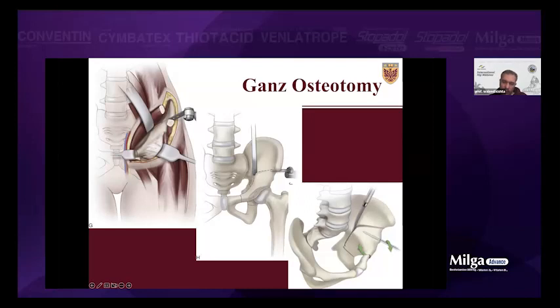This is a very perfect view, and this is a cut we did initially. The superior pubic ramus cut is done through the same approach. So I do everything from the same bikini incision, and I do the rectus sparing. So I keep the rectus and I keep the sartorius. I do a little bit of ASIS osteotomy, get a little chip of bone from the anterior superior spine, then I repair it again. Be careful with this part because you can injure the inguinal ligament and get an inguinal hernia.